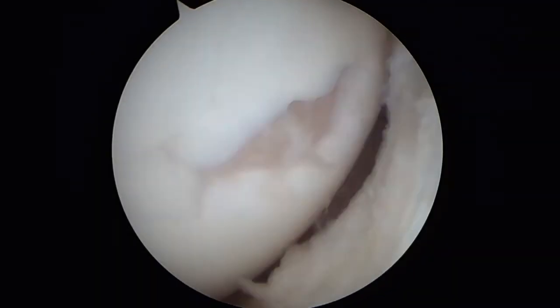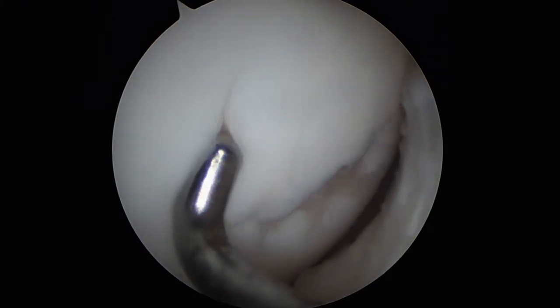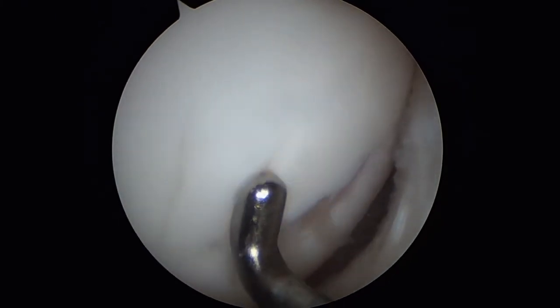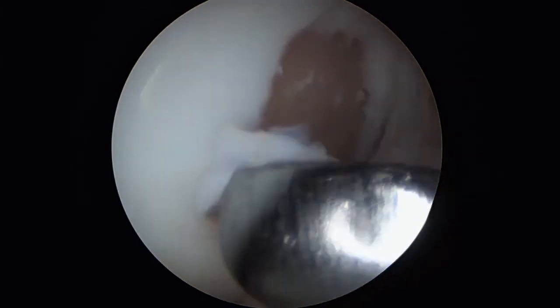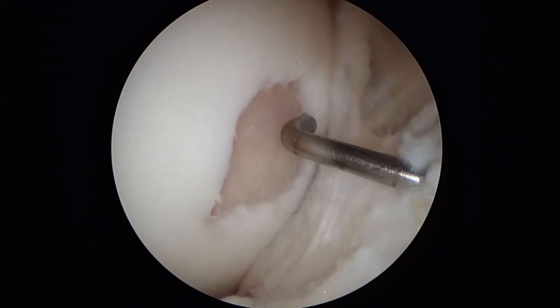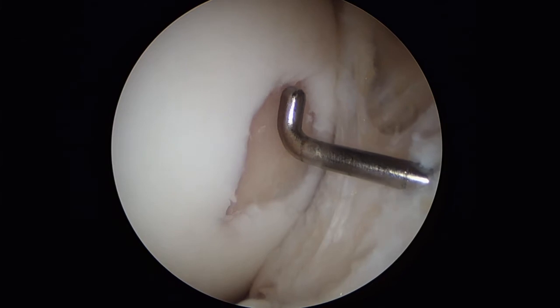This is the arthroscopic view on the medial femoral condyle. A probe is used to measure and grade the defect. A sharp curette is used to remove loose cartilage fragments and stabilize the margins with vertical walls. The defect size is then measured with a probe.